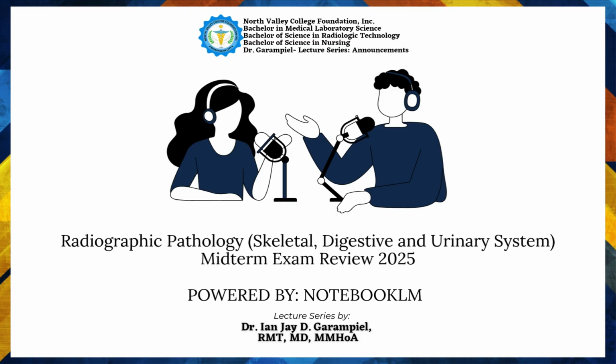We're starting with the structural foundation, the skeletal system. And we begin with the absolute basics of imaging. If you suspect a fracture, the crucial first step is often overlooked. You must obtain two projections, two pictures, as close as possible to 90 degrees to each other. If you don't get that perpendicular view, you can completely miss the actual relationship, the displacement of the fracture fragments. That immediately clarifies why just one picture isn't enough. You can't tell if the bone shifted forward or back just from the front.